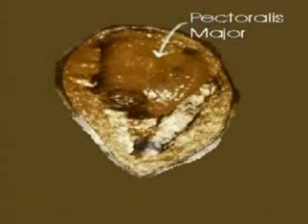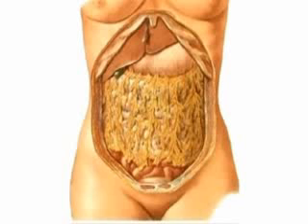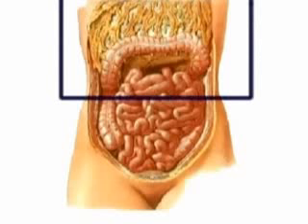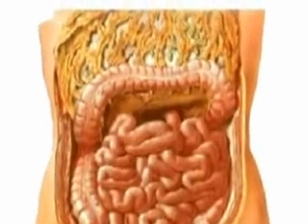Chronic sternal wound infections are a source of major morbidity after cardiac surgery. Traditionally, a pectoralis major or rectus abdominis flap has been used for reconstruction. The omentum provides a mobile, well-vascularized tissue pedicle that can fill a large defect. With minimally invasive surgery, the omental flap, which can reach as high as the sternal notch, is an ideal source of tissue with less morbidity compared to the traditional flaps.